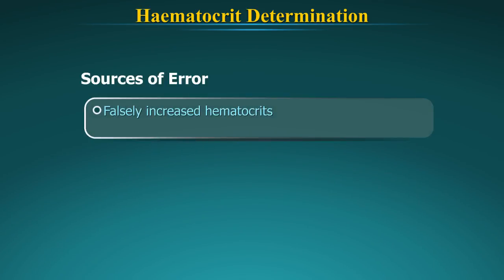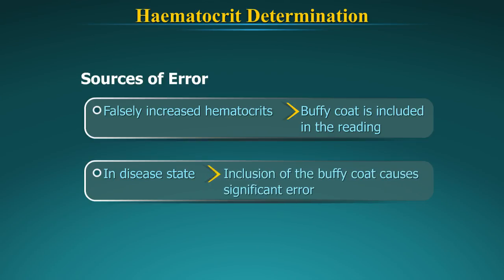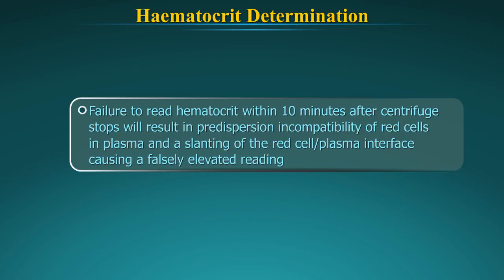Falsely increased hematocrit may be reported. The buffy coat, which is comprised of white cells and platelets, is usually a very thin whitish layer above the red cells that can be observed when the blood is centrifuged. In disease states where the white count is excessively elevated, inclusion of the buffy coat can cause a significant error. Failure to read the hematocrit within 10 minutes after the centrifuge stops will result in redispersion of the red cells in the plasma and a slanting of the red cell-plasma interface, causing a falsely elevated reading.